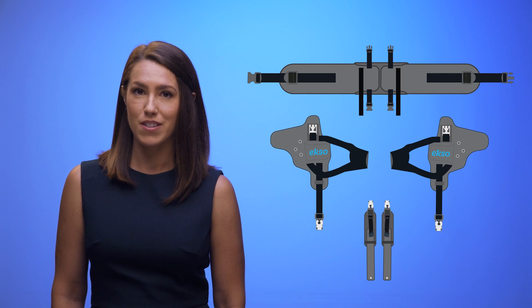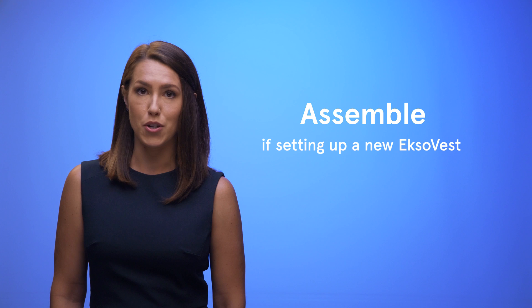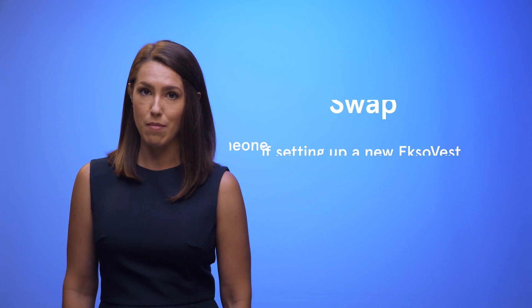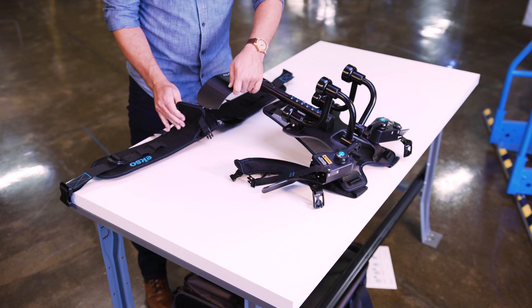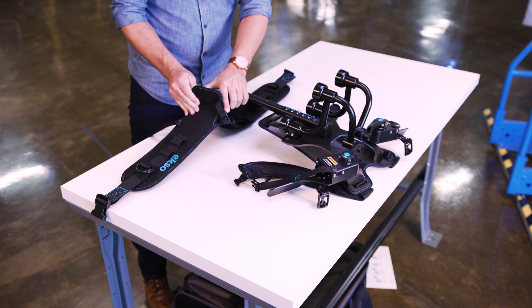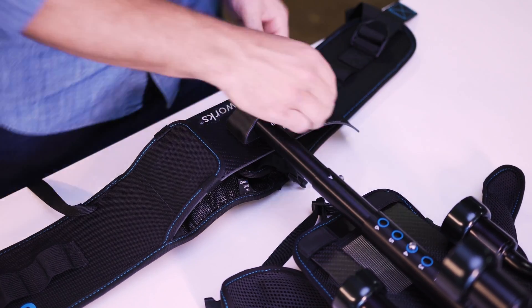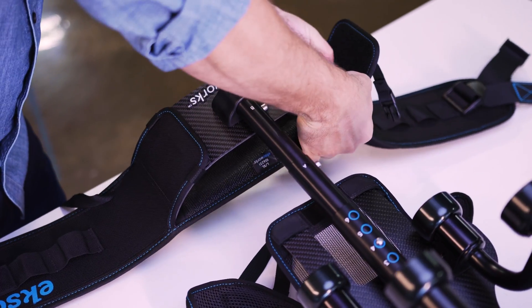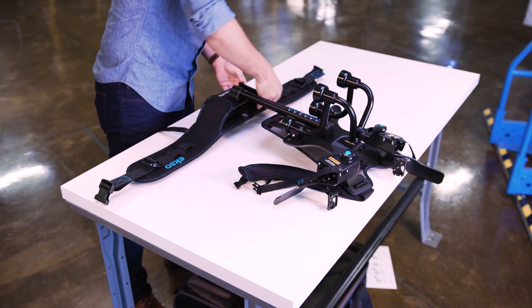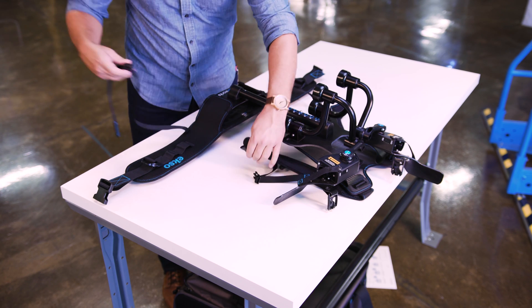Now that you have your hip belt, arm cuffs, and arm straps, it's time to get them on your ExoVest. You'll have to install the soft goods if you're setting up a new ExoVest, or swap them if you're getting one from someone else. Make sure the hip belt is right side up and the waist plate is fully seated in the pockets. Velcro and buckle both sides of the hip belt, then attach the shoulder straps. It might be easier to lay the ExoVest flat on the table to do this.